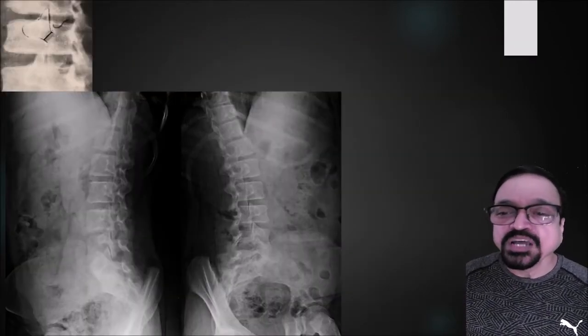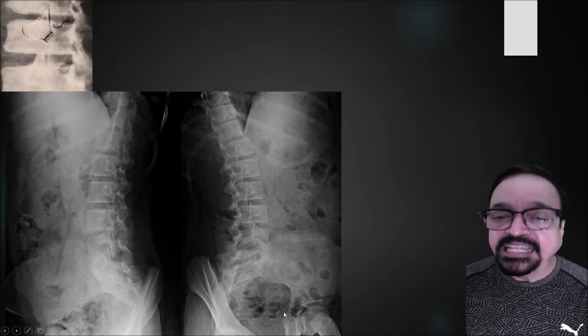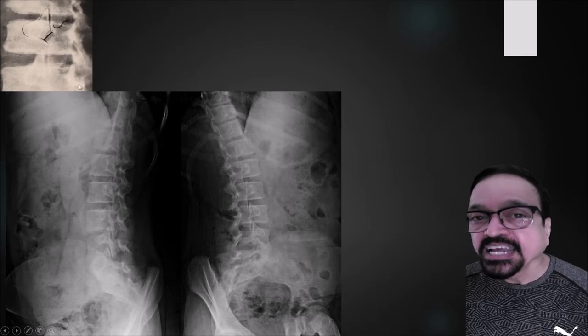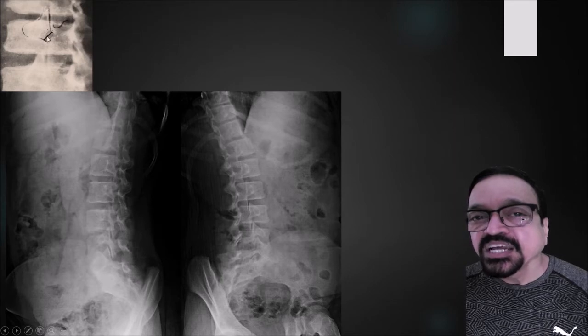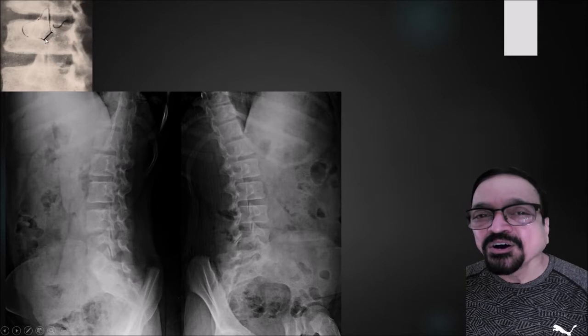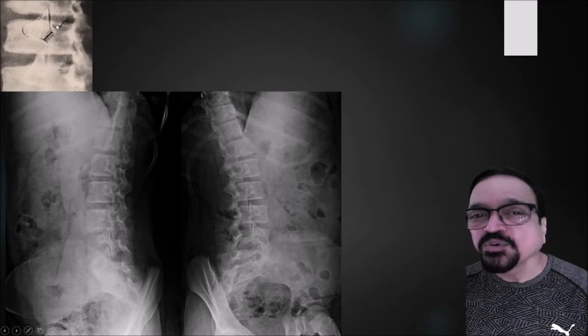Now these two oblique views we are seeing. Here the most important thing, these are taken for spondylolysis. Now this picture shows you a Scotty dog appearance. Now this is the mouth of the dog, these are the ears, this is a belt. The belt indicates a breach or defect in the pars interarticularis, which corresponds to spondylolysis. These are the front legs of the dog. So that's how it is described as a Scotty dog appearance.